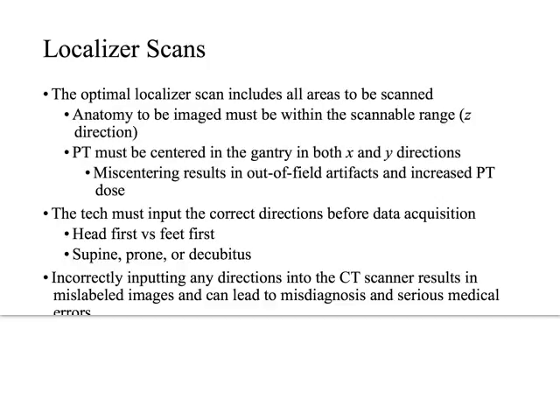So you have complete power over this. And in the machine, like on a GE scanner, there's this little guy named Tom. He looks kind of like a Lego man or something, right? And you can flip him around. You can tell the machine, okay, Tom is laying on his back with his head towards the gantry. Or Tom is laying on his back with his head away from the gantry. Or Tom might be laying on his side or on his stomach. You can flip this little guy around.